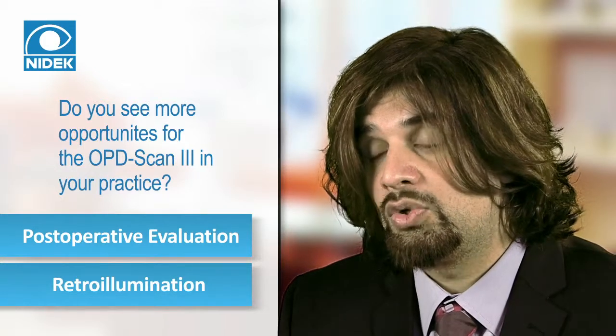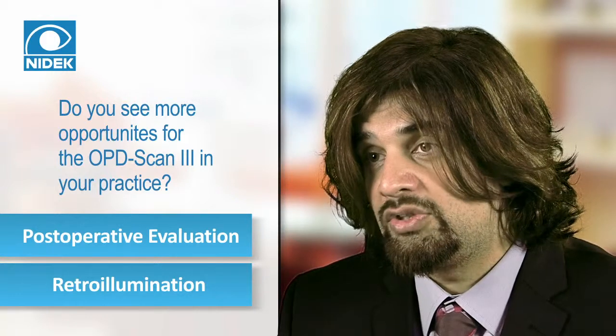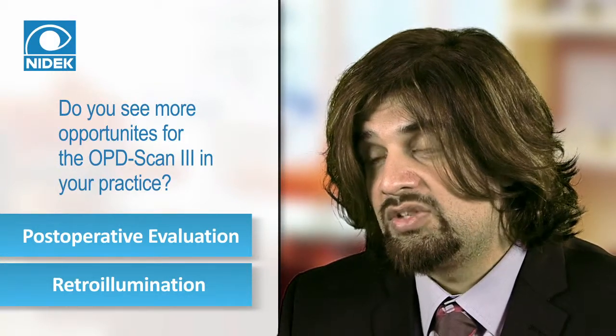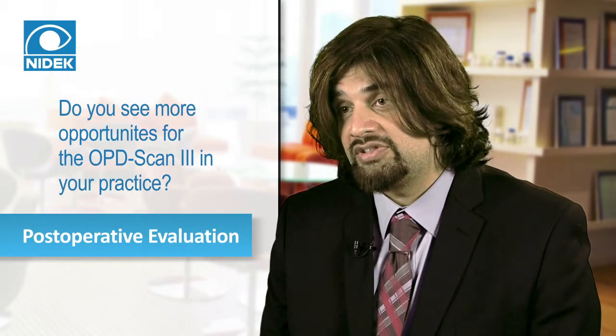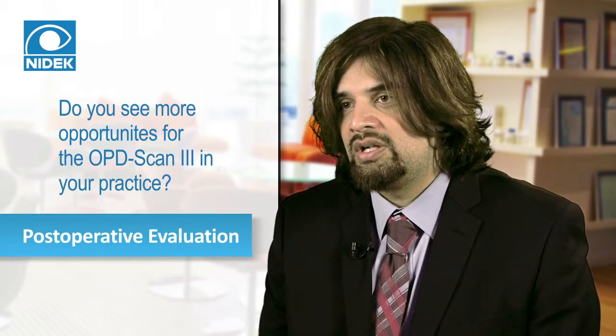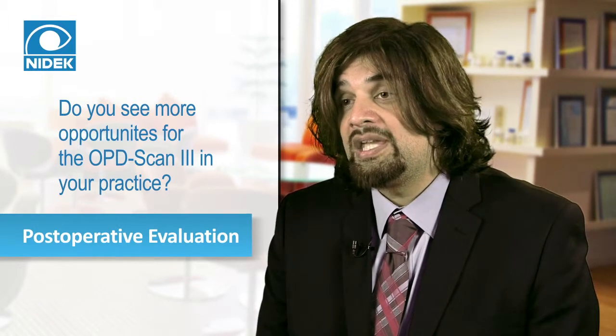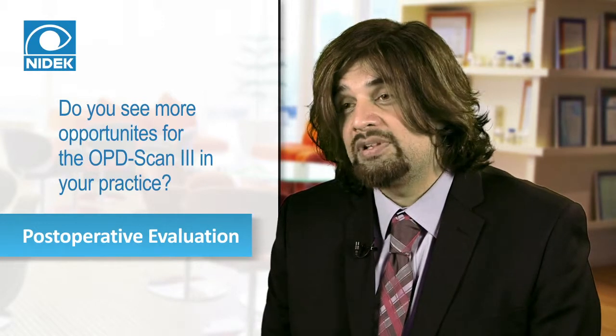And so being able to assess, for example, with retroillumination, the toric IOL tool, which is very nice to be able to see and evaluate where the toric IOL is planned and placed, is a great method to evaluate how accurate we are. It also helps us to evaluate the total higher order aberration in the system as well. It may explain why a patient has visual quality issues. So the postoperative evaluation is another aspect of our practice, and it can be especially helpful for patients who may not be completely satisfied, in evaluating exactly what the problem is.